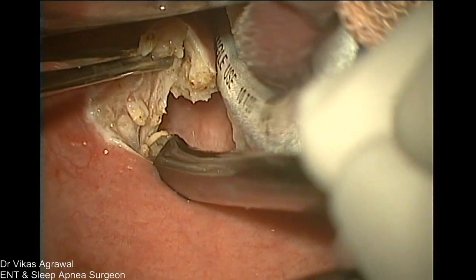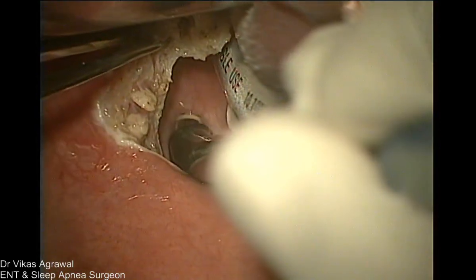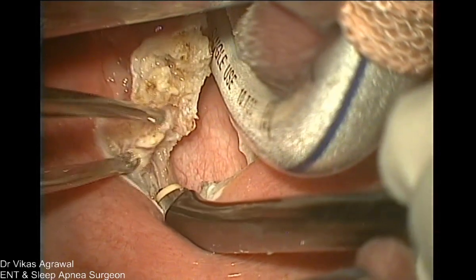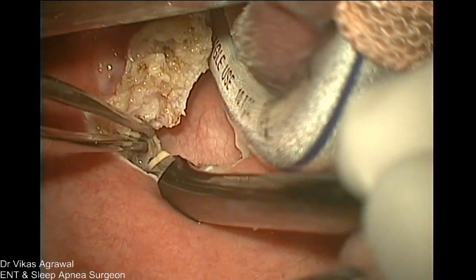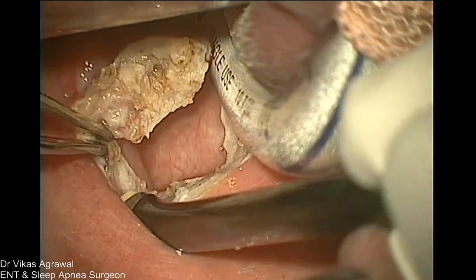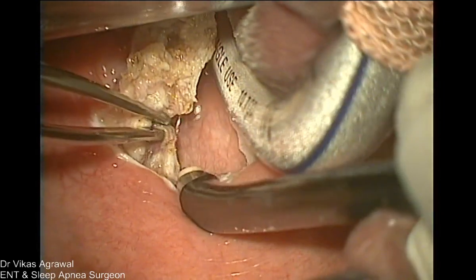Right. Now see, I have actually cut and removed the fibers of the palatopharyngeus. Now can you see the vertical fibers here? Yeah, seen very well. Just a little more of the oblique fibers. Let me remove. And I'll stop as I reach the lateral pharyngeal wall. Can you see that? Yeah. So I'm not damaging the mucosa of the lateral pharyngeal wall, because if I do that, then the patient will have velopharyngeal stenosis. Is that correct?